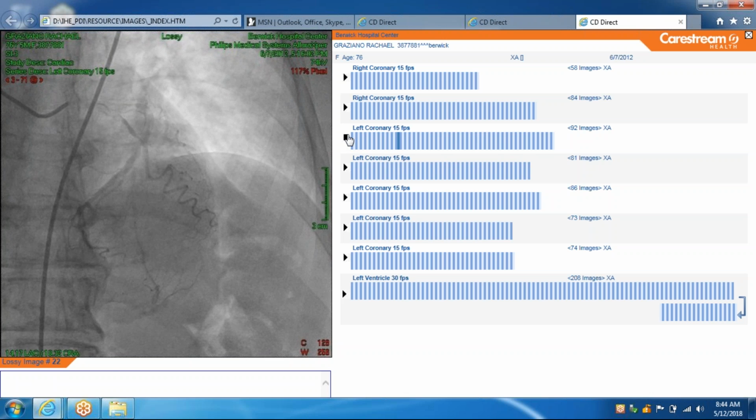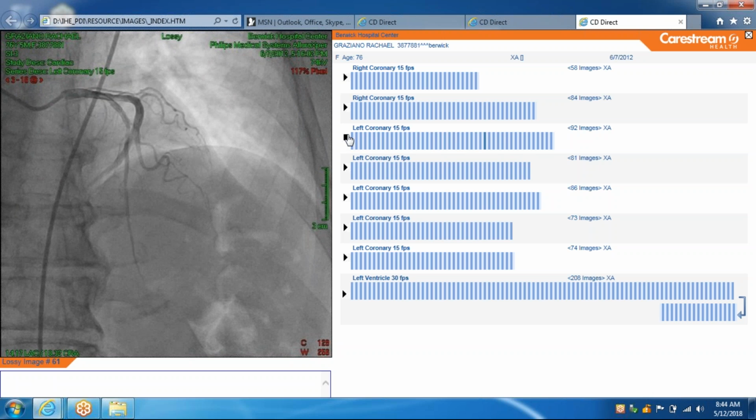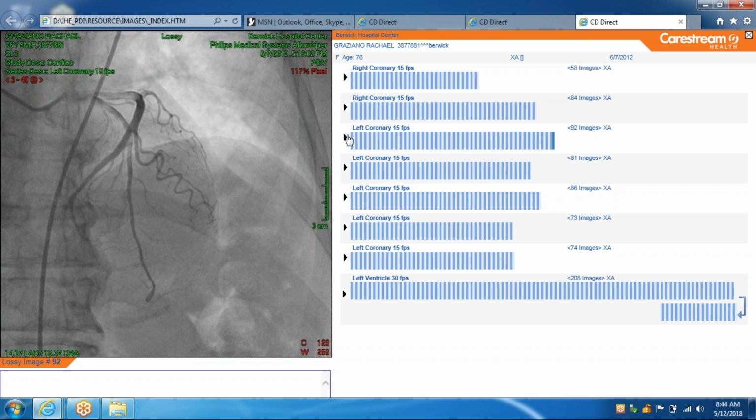Again, the size of your catheter is about 2 millimeters, so you can judge the size of the vessel from that. You can see that the left system is much bigger than what was on the right side for this patient. So this vessel, especially in the LAD, is probably 3 millimeters. It tapers down a bit, but the mid and proximal portion, the mid is probably about 2.5 to 3, and the proximal is definitely a bit larger.